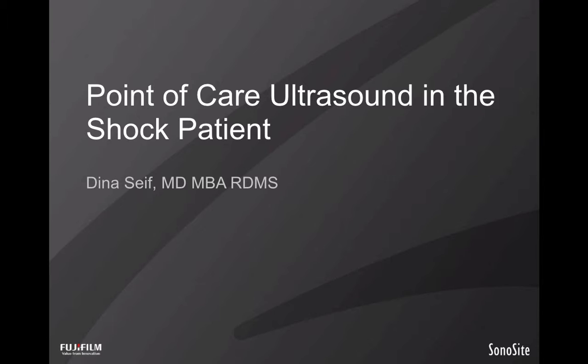This lecture will demonstrate how to use bedside ultrasound to evaluate reversible causes of shock rapidly in patients with undifferentiated hypotension, dyspnea, or cardiac arrest.